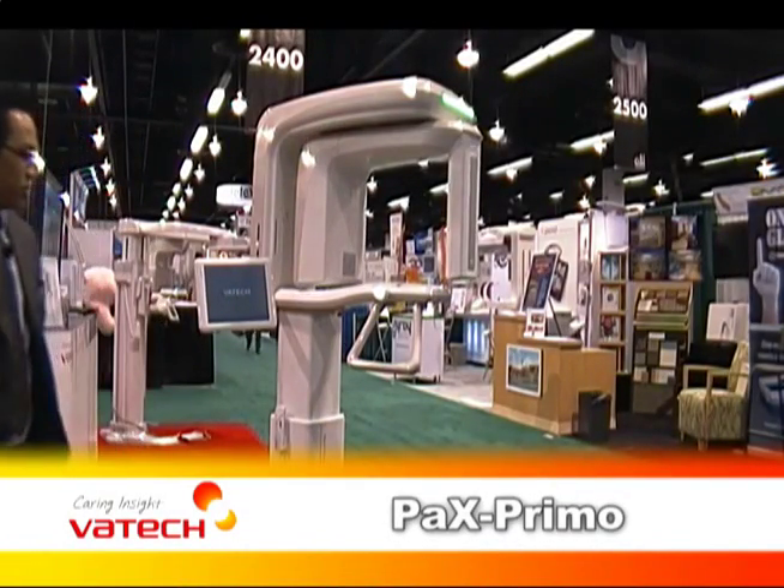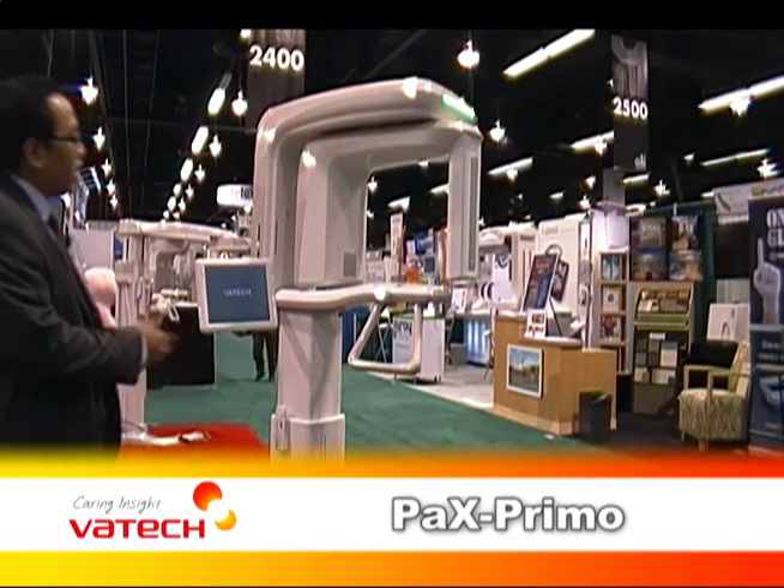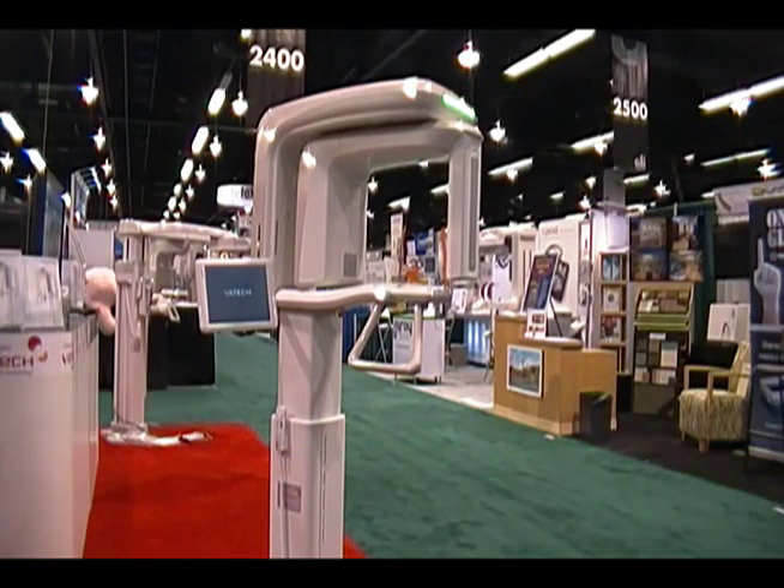This is the Pax Primo from Vatech America. It's an integrated digital pan. As you can see, it's a very compact design, very small, and easy to fit in most dental practices.